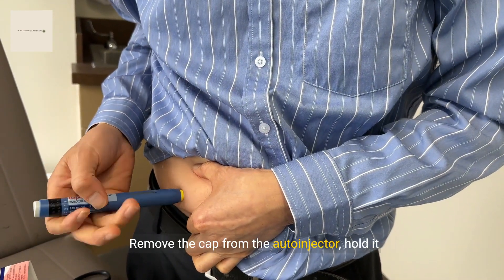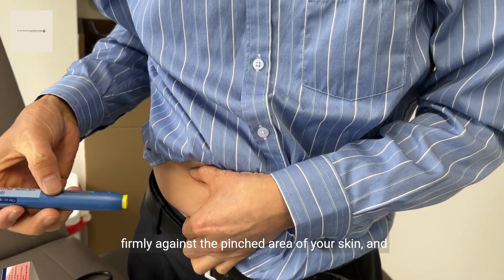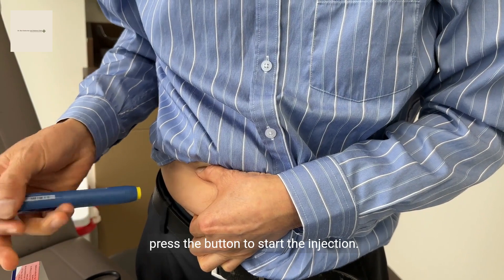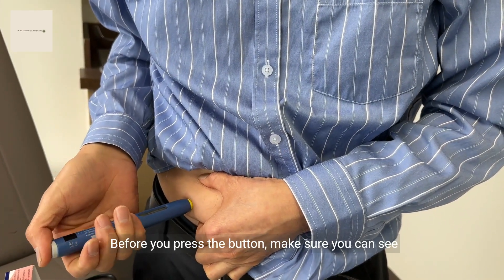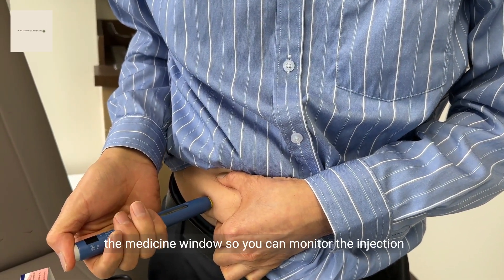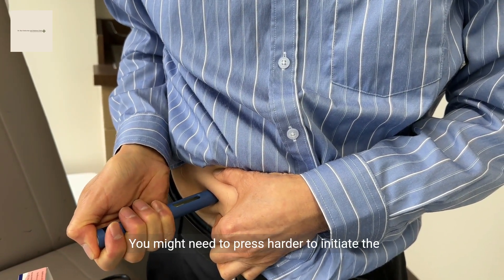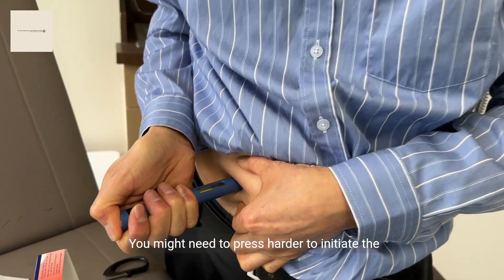Remove the cap from the auto-injector, hold it firmly against the pinched area of your skin, and press the button to start the injection. Before you press the button, make sure you can see the medicine window so you can monitor the injection progress. You might need to press harder to initiate the injection.